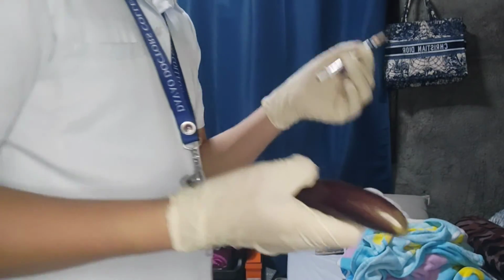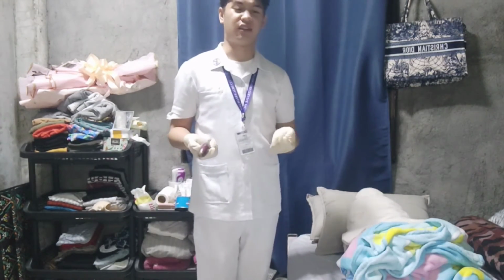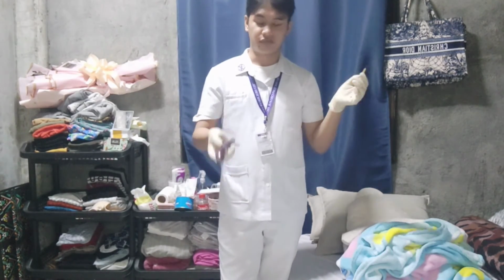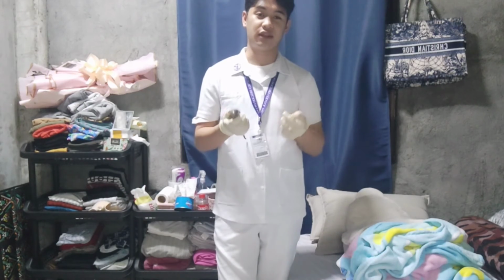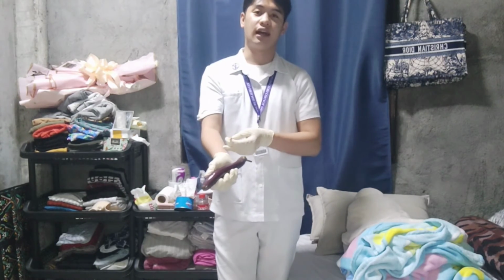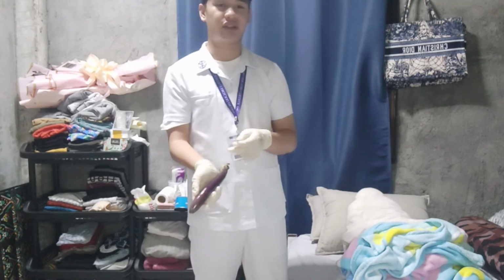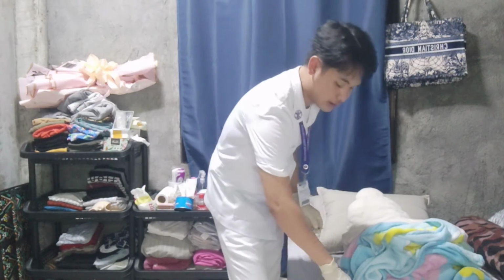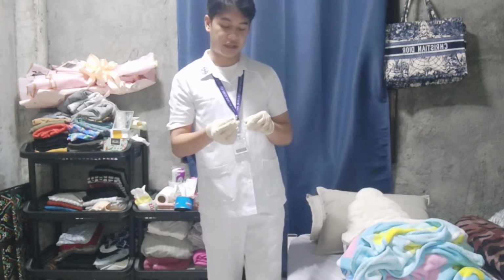The next thing you're going to do is you must not massage the area, because massaging the area can cause tissue damage. If you see a red wheal or blisters on the hand of the patient, and there are some irritations occurring around the blisters, the patient might be allergic to the medication.